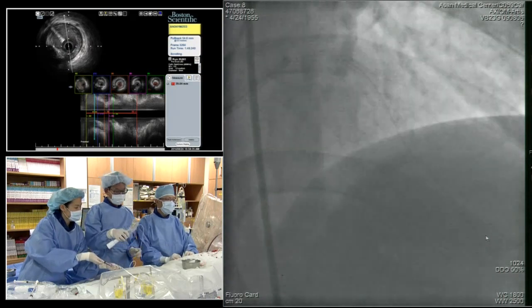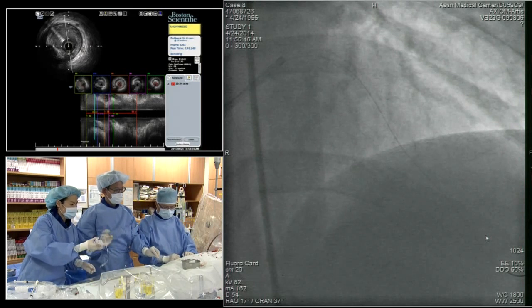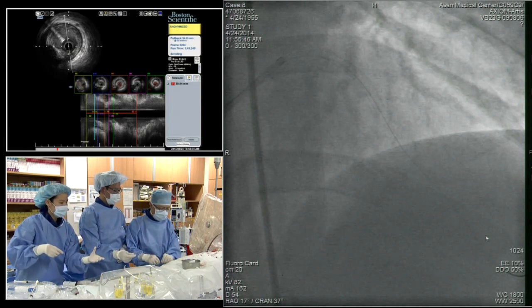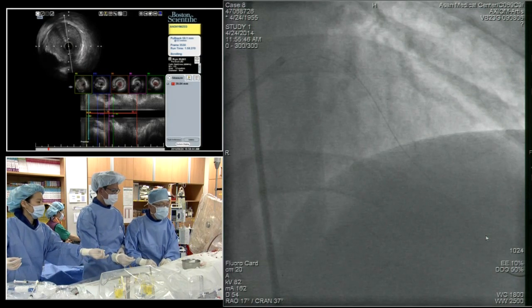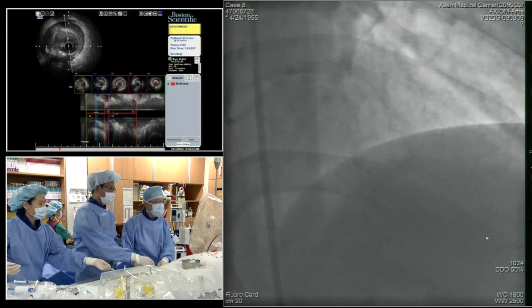But in a situation like this, I think you're probably going to have to size up the left main anyway. So in this case, I might not have done a second inflation. I agree with you. Yeah, I think it's the size of it. You have a 5.8, it looked like, or at least 4.5.